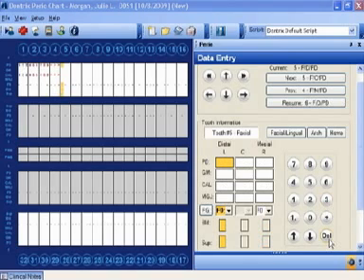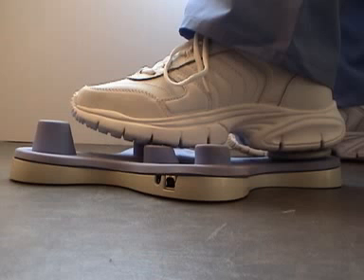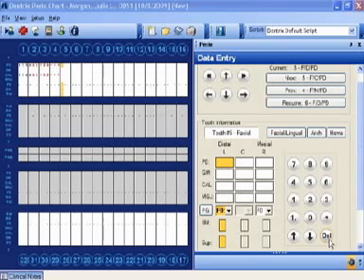Your heel button is working as your leg rest, but it becomes the left mouse click when you're rocking back on the back side of it. So you can actually rest your foot there, and then only when you rock back is it going to be the left mouse click. So that allows you to mark your bleeding while you're doing your numbers. You can just have your mouse parked.